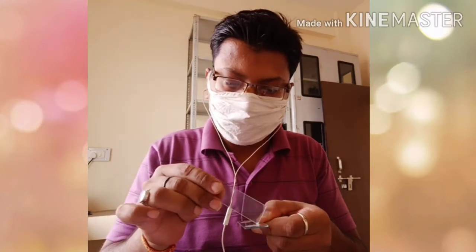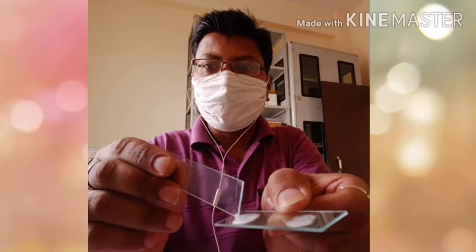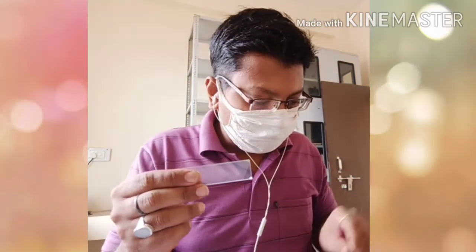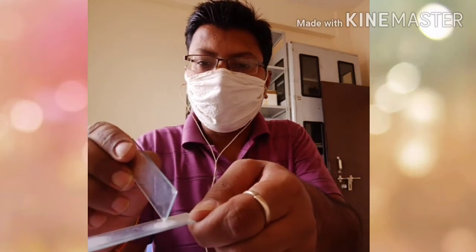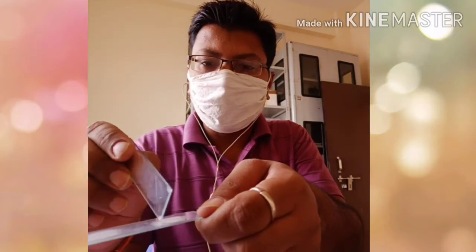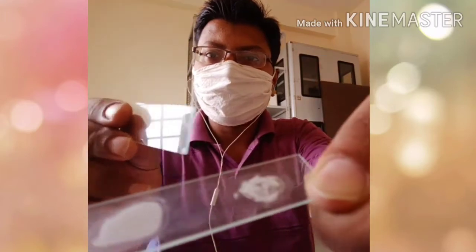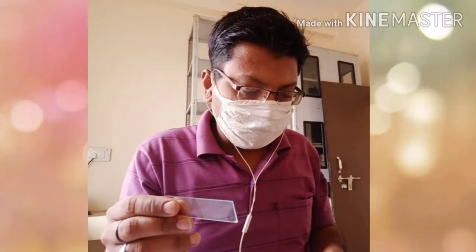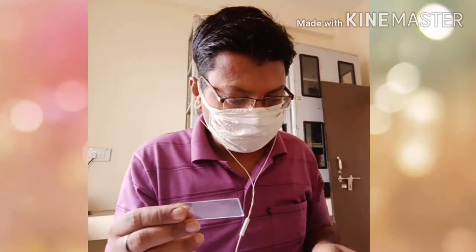Here I put one drop of milk and one drop of CMT reagent and mixed it gently. If the milk is contaminated or the udder is mastitic, then clumps of the neutrophil's DNA will be prepared. Look at this slide — there are clumps of DNA from the neutrophils, so we can say that this is mastitic milk. If the number of neutrophils is less, then there is no mastitic milk.